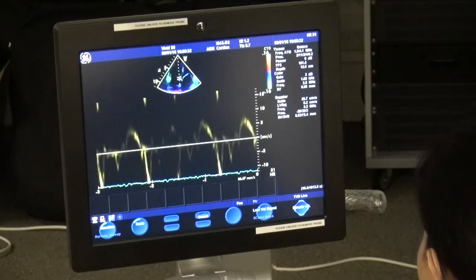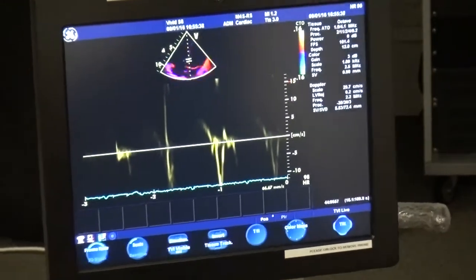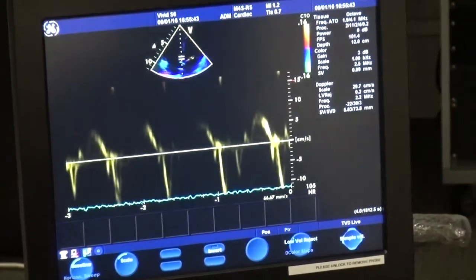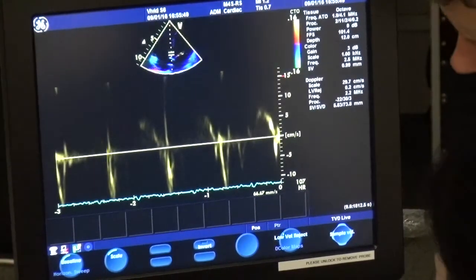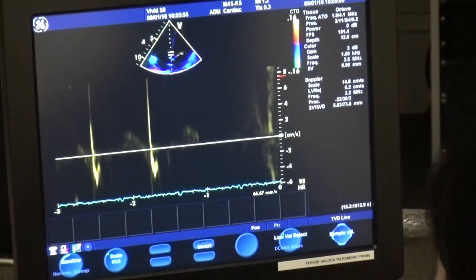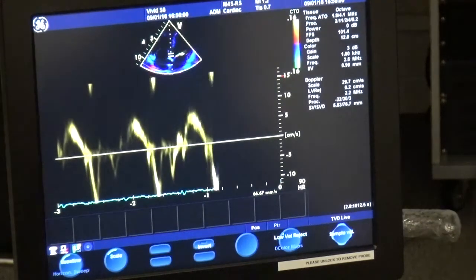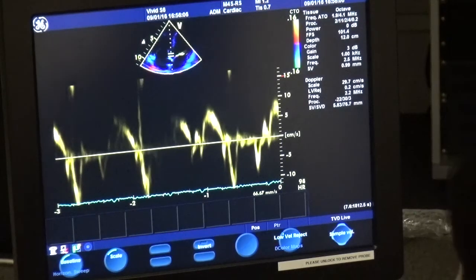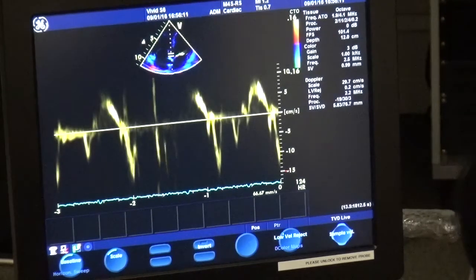Okay, and you can see the tissue velocity trace there, and we've just got a slightly smaller scale than we need. Okay, is it that one? Scale against this one. Biggest. Okay, twist again, or just move the baseline up a little bit. The baseline is the one next door, so that's it. Perfect. So you've now got systole and diastole. You can freeze that.